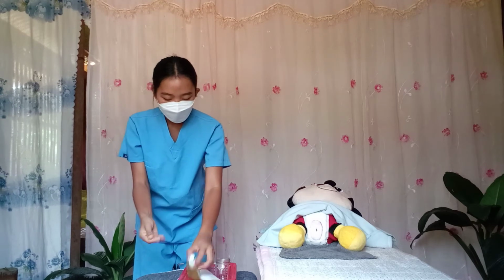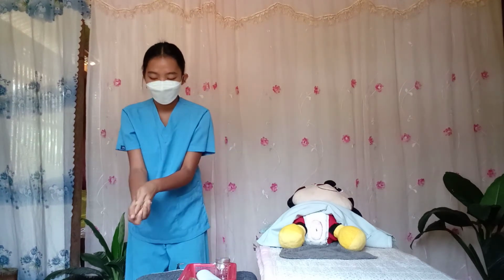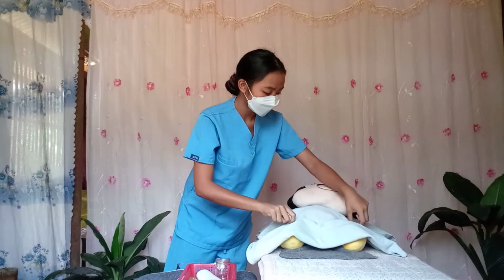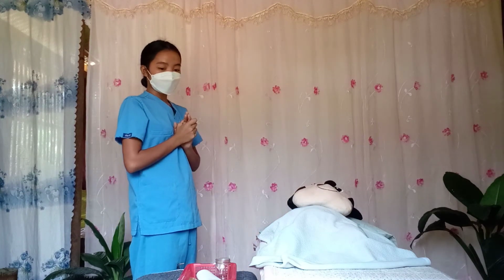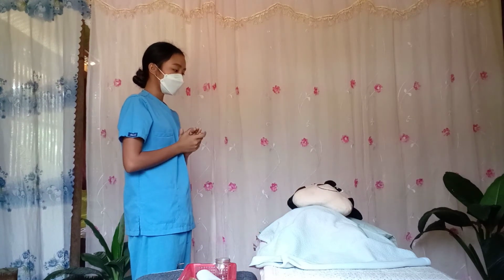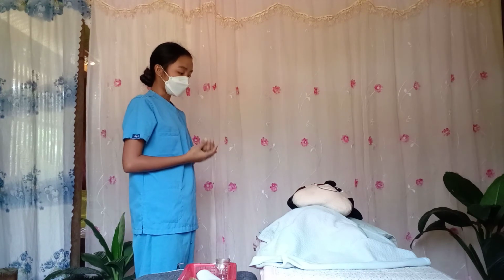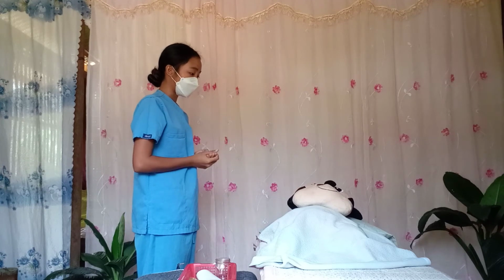And I am going to perform hand hygiene and cover the patient. So, ma'am, I want you to drink plenty of water for you to be able to have a normal excretion of urine.